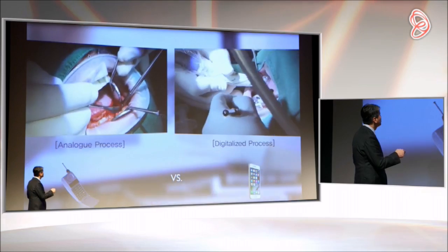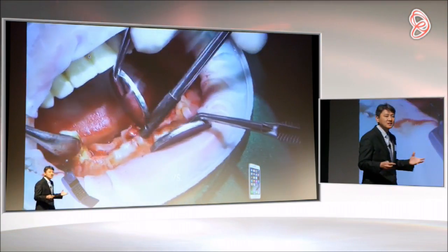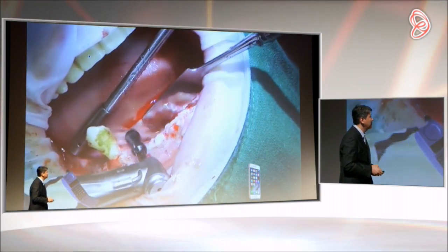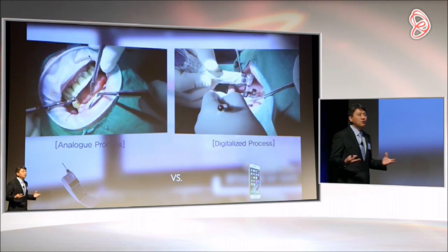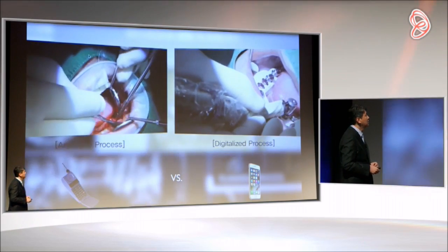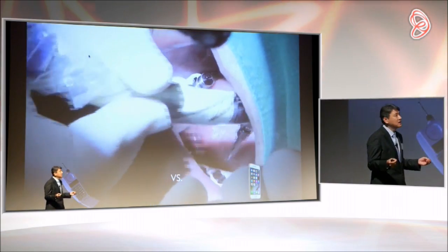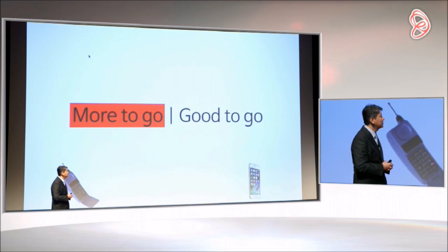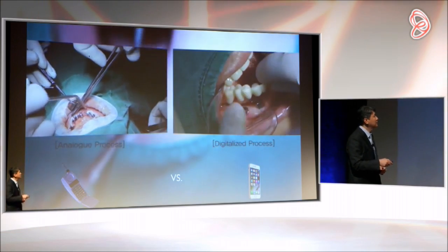So rather than opening a flap, causing a lot of bleeding and pain, why don't you use digital surgery so that you don't open any flap to your patient? Why are we opening the flap and doing bone reduction where we can do a digitalized process where the patient is not bleeding, is more accurate than freehand, and the patient will love you because we can even deliver prosthesis on the same day.